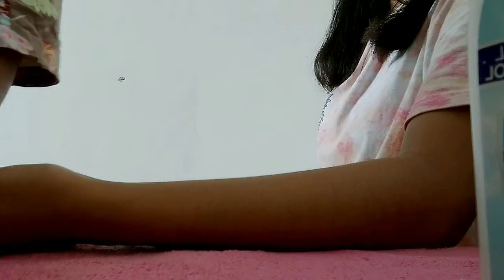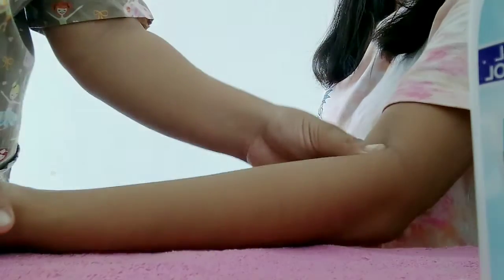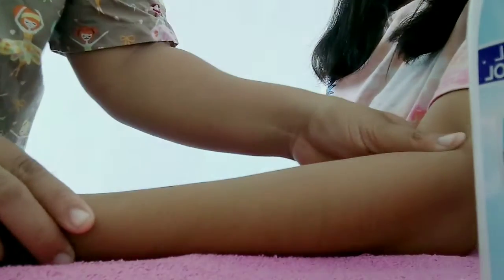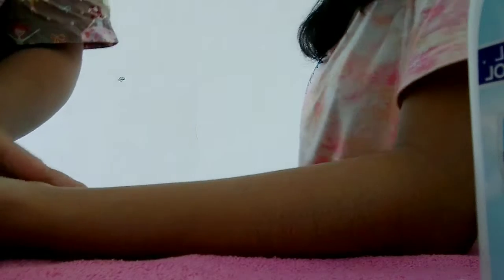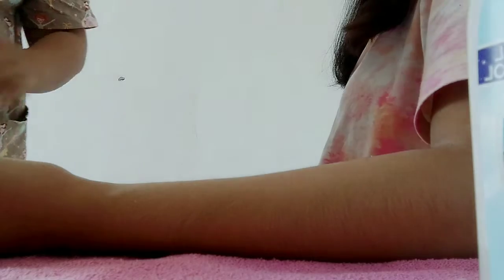Then next, we are going to perform hand hygiene. Now select an injection site that is free of lesions or skin discolorations. Position the client's arm so that the forearm and the elbow are on a flat surface. And then we are going to apply clean gloves.